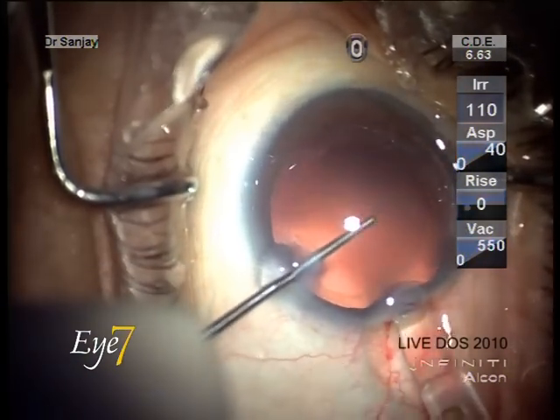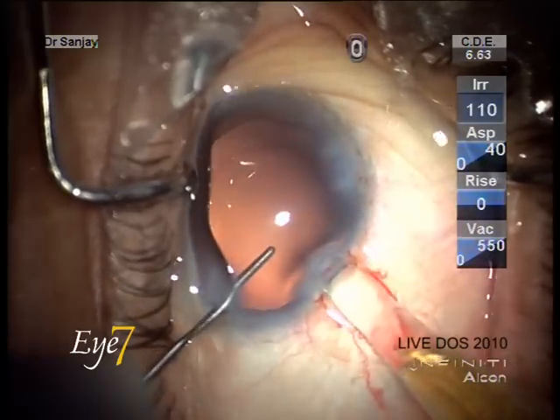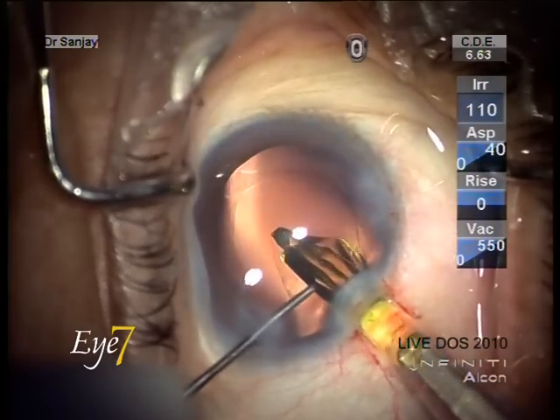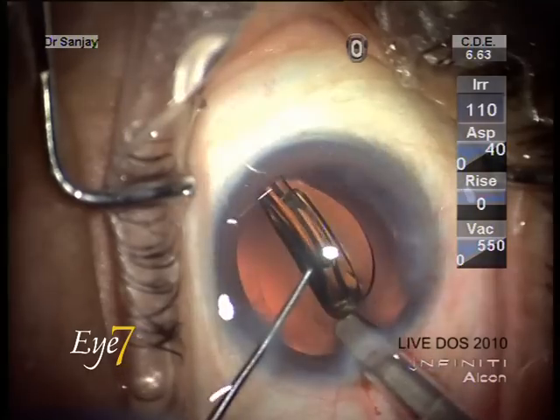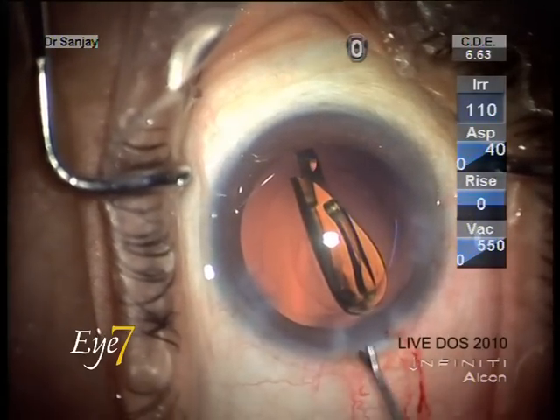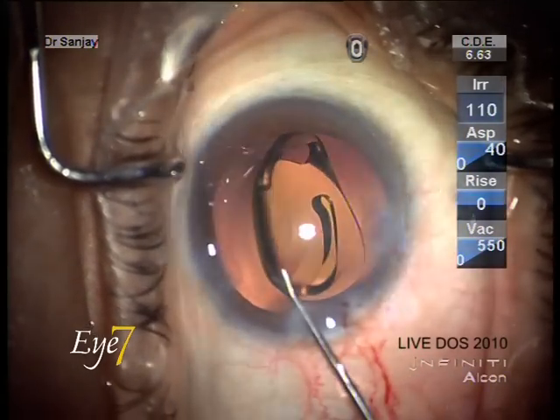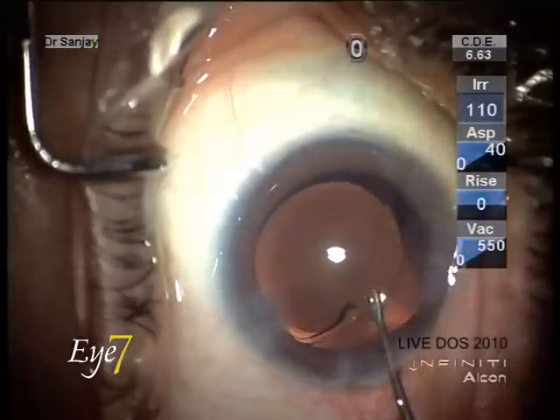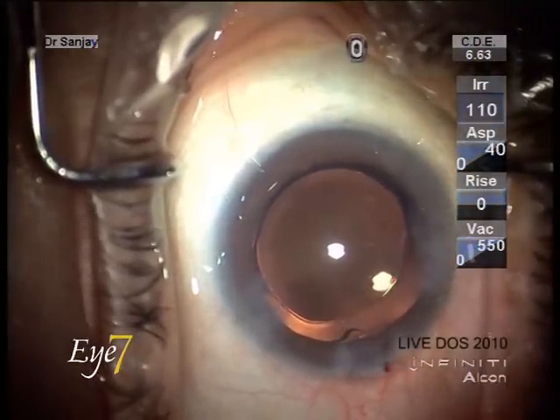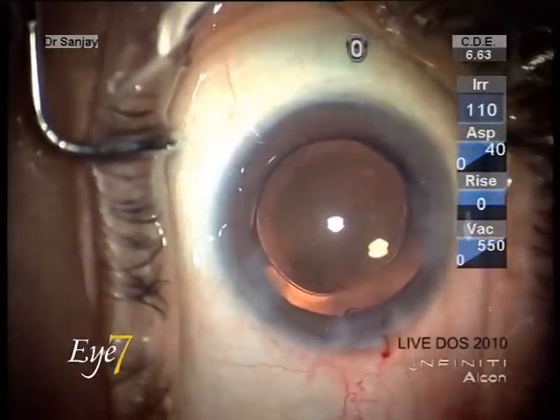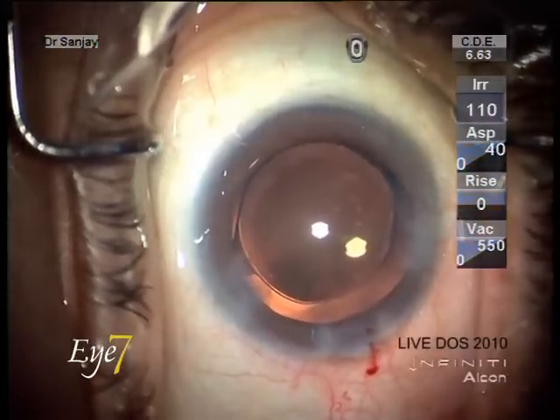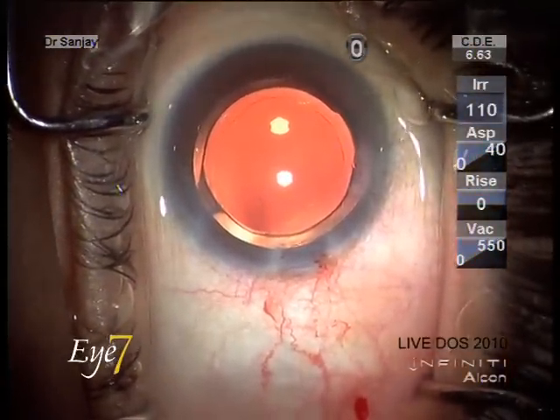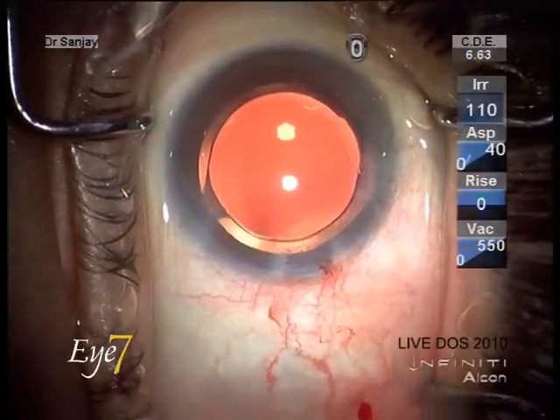With side port entry using the probe to stabilize the eye, the cartridge is placed in the tunnel of the wound — this is a wound-assisted delivery. We do not enter the eye; only the lens gets injected into the chamber and opens up into the capsular bag. We dial it into position as the haptics open up, and now you can see the lens is in position with the rings visible.